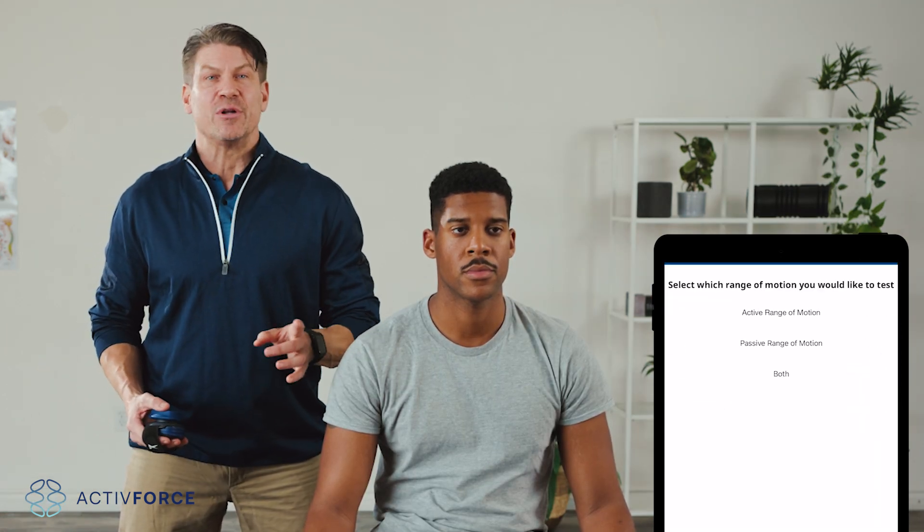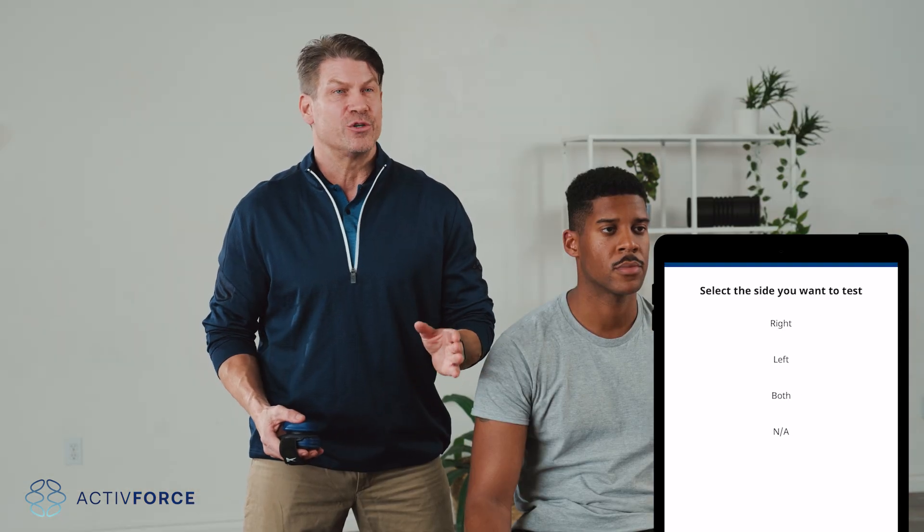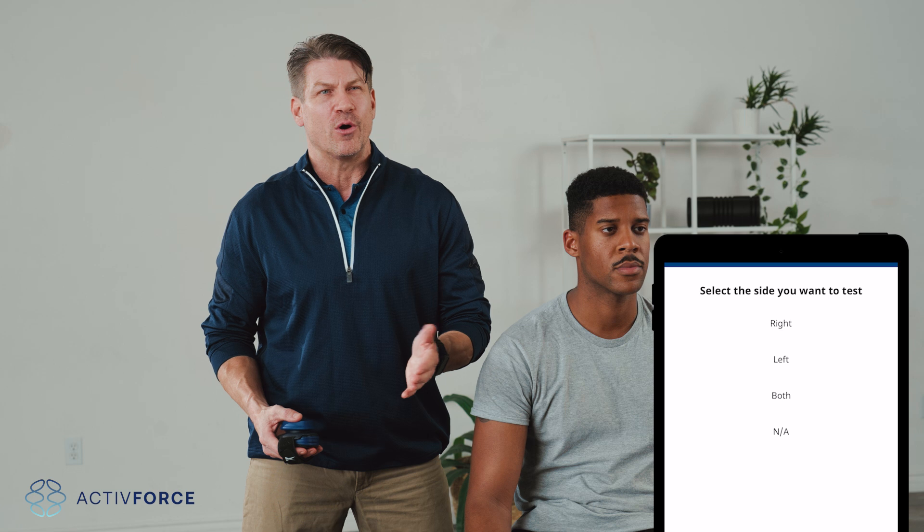Now let's test range of motion. Select range of motion on the app and choose between active, passive, or both. Select the type of motion you're testing, then choose your side preference: right, left, both, or not applicable.